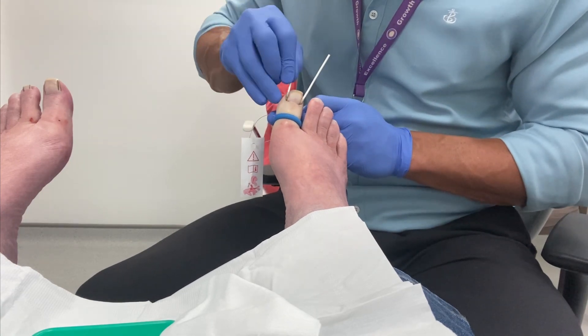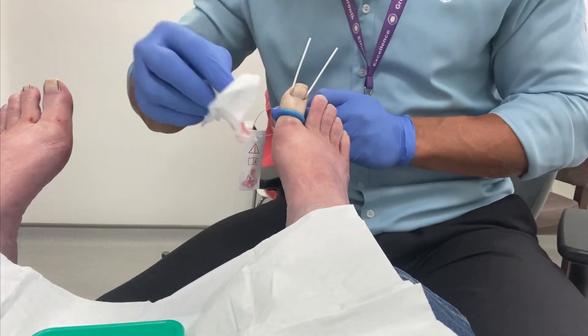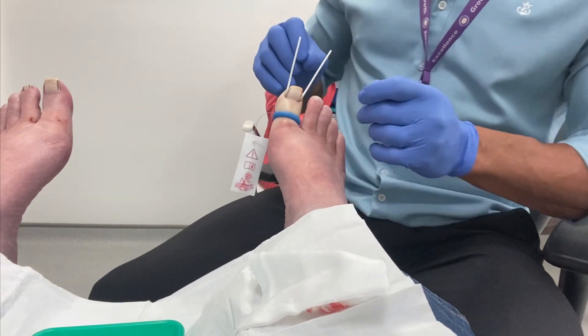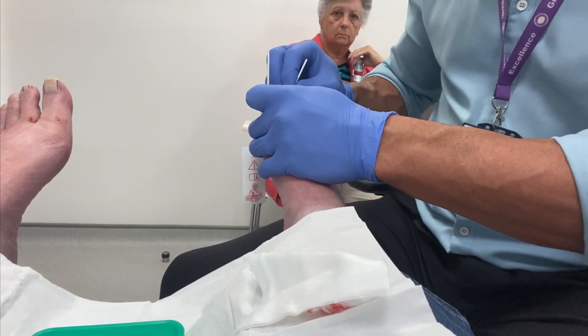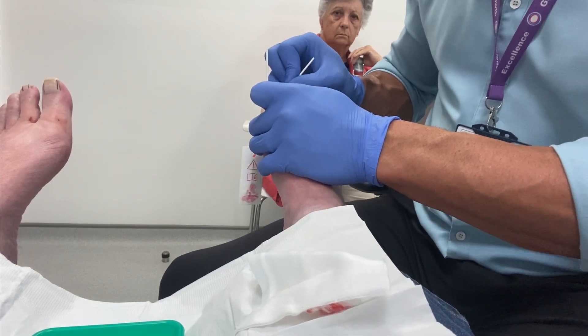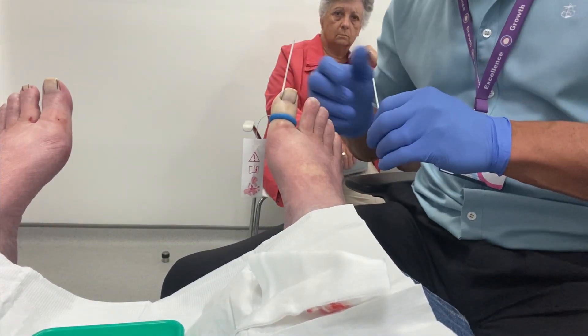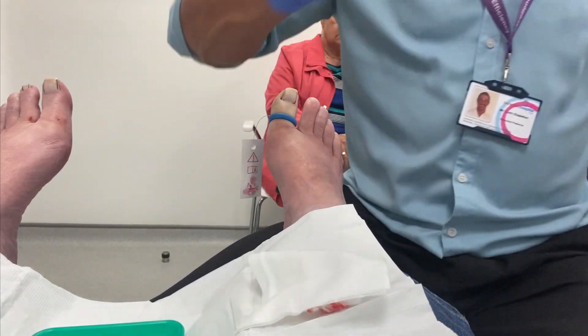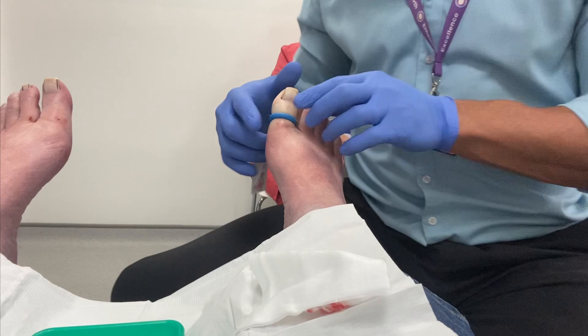We know this procedure has a success rate in the high 90%, with recurrence being a very low proportion of that, and certainly a significant improvement on previous surgical excision procedures that were performed many years ago.